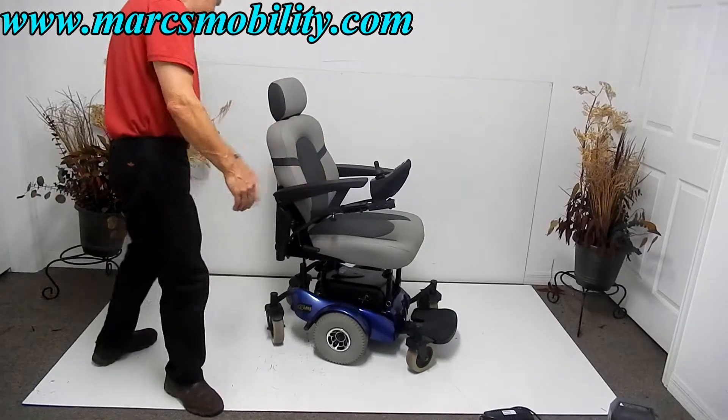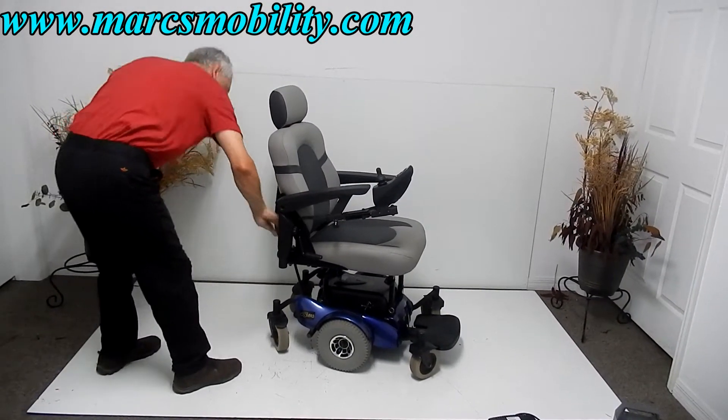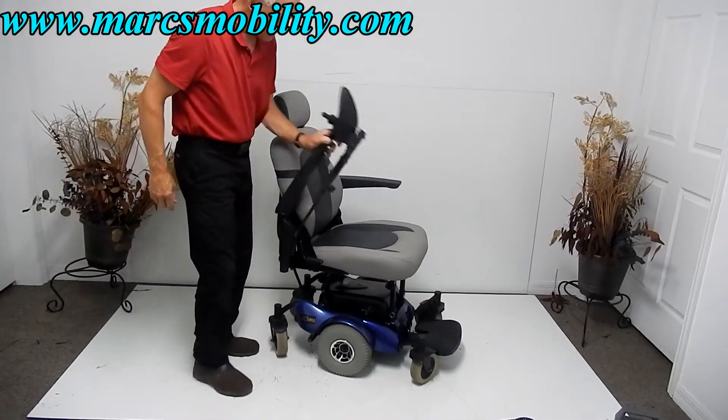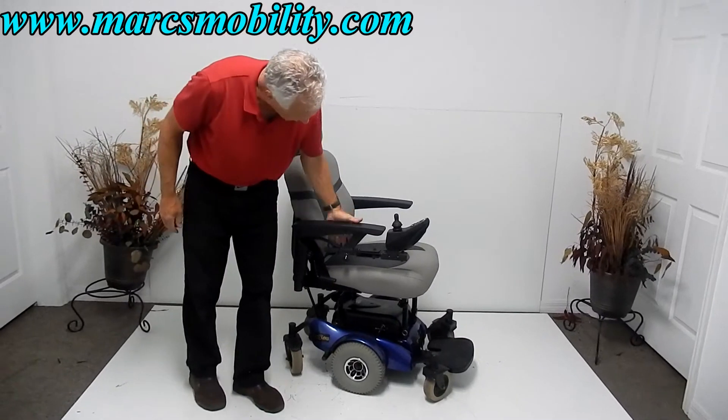The arms are adjustable in and out, and they also go up and down for easy access on both sides. They are a little stiff — I need to loosen them up — but they do go up and down easily.